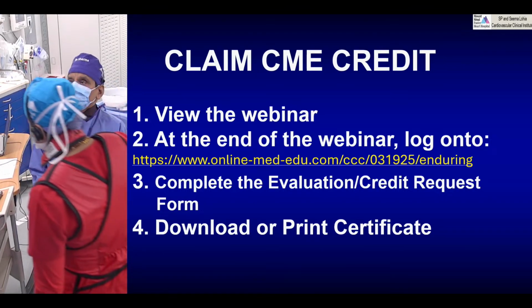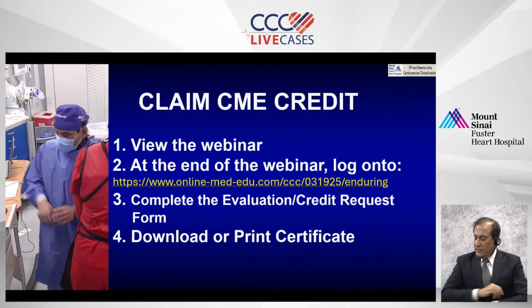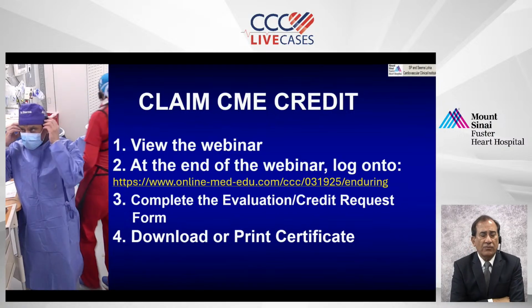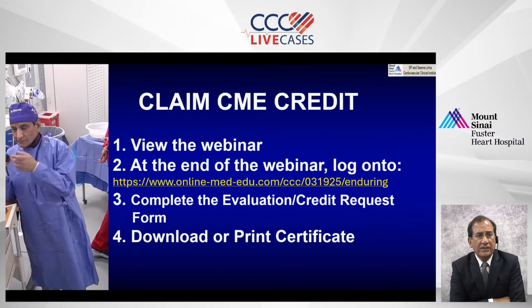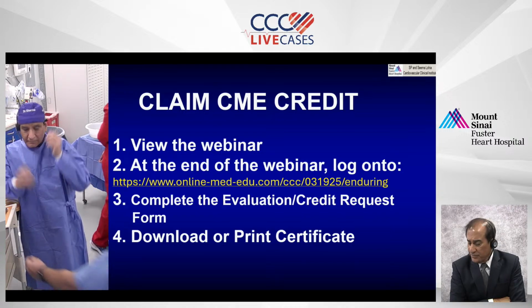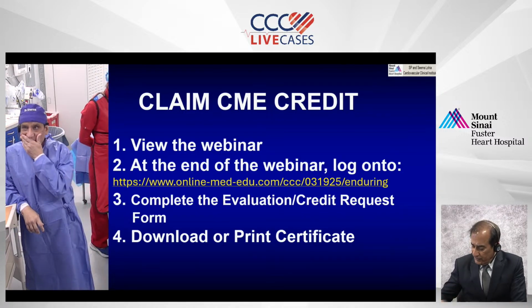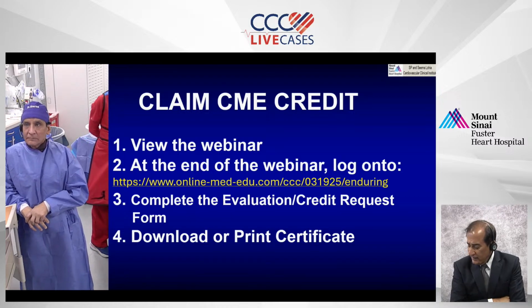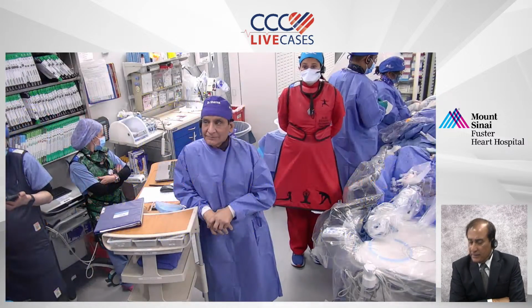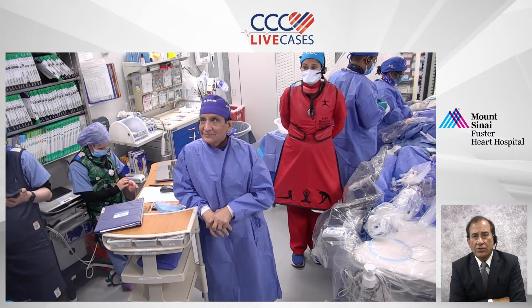Samin: Yeah, a quick, I have a few follow-up questions, and then of course, I look forward to Dr. Kinney providing a summary of the case and the tips and tricks which people should have learned. So first of all, Anu, congratulations for, what I called it here, the BRS, the bifurcation risk score.